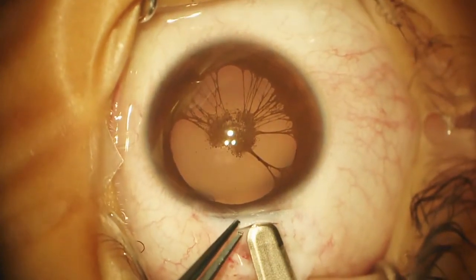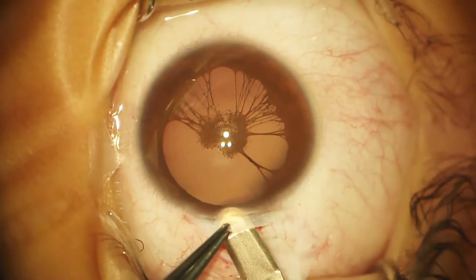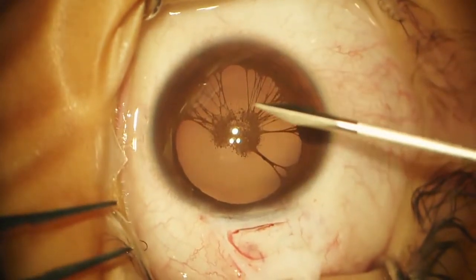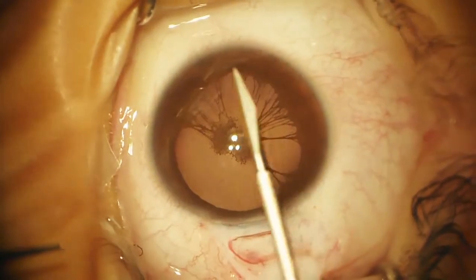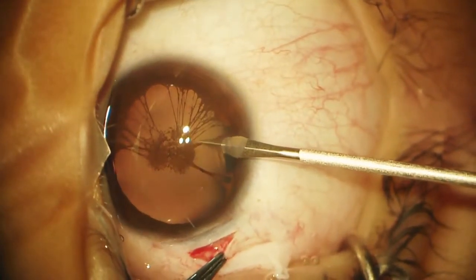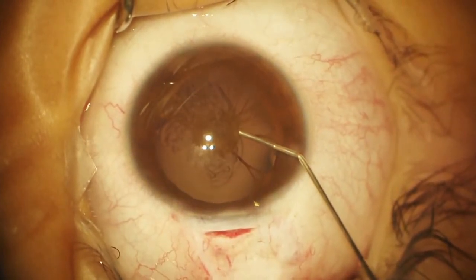I've switched to a forceps without teeth — this is very gentle for handling conjunctiva. A lot of glaucoma surgeons use this because it's gentle and it won't tear up the wound. We go just into clear cornea. Now I'll take a paracentesis knife — we want to make incisions in locations that will help us lyse these little membranes all the way around. The eye has gotten quite soft, so we'll go ahead and fill it with OVD, with the viscoat.